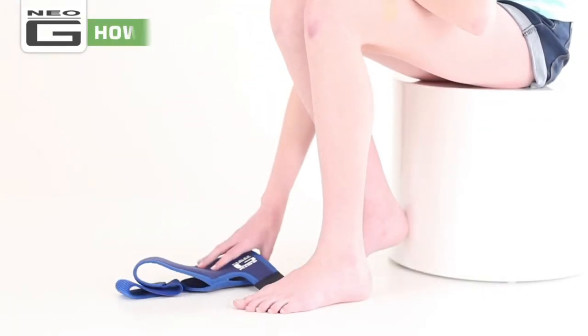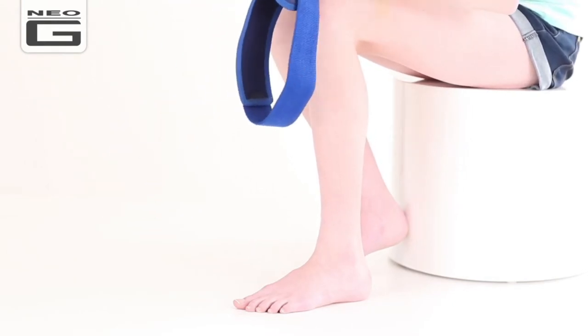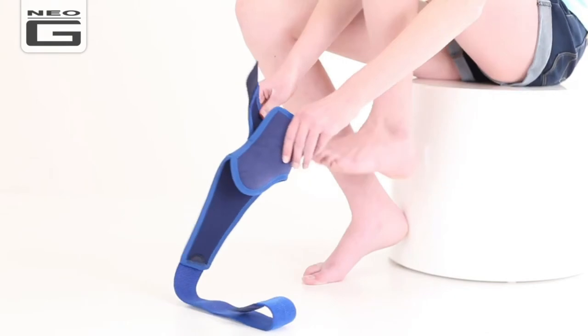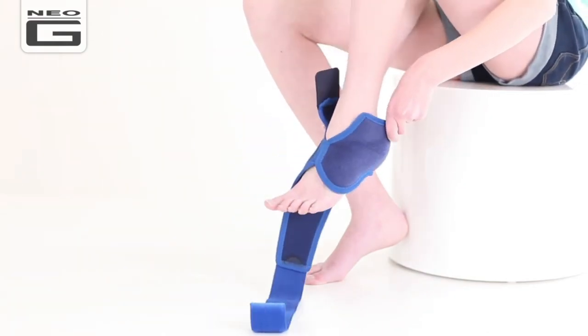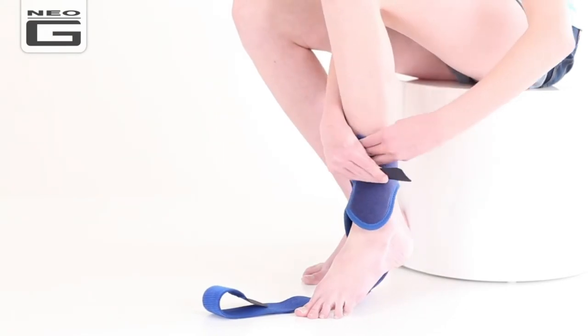With adult assistance, slip the toes and the ball of the foot through the opening, ensuring the Neo-G logo sits on the ankle. Wrap the upper strap around the ankle and secure the fastener.